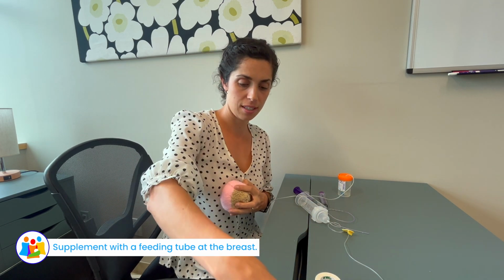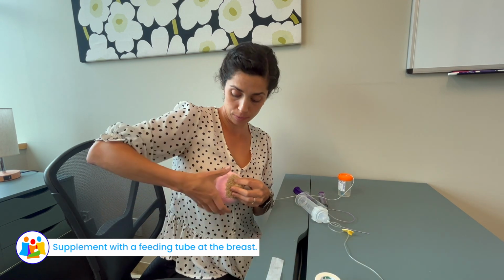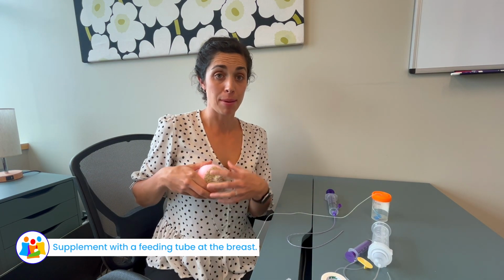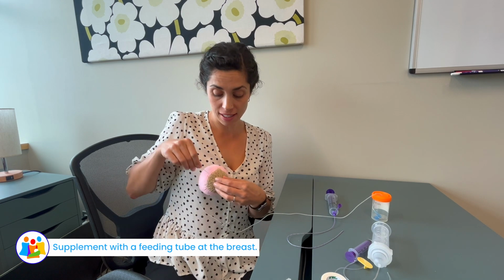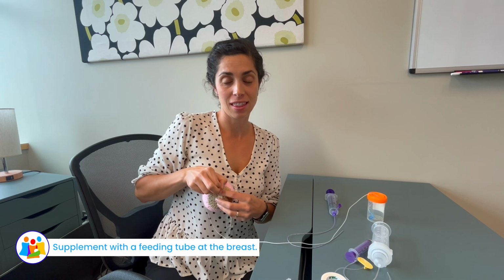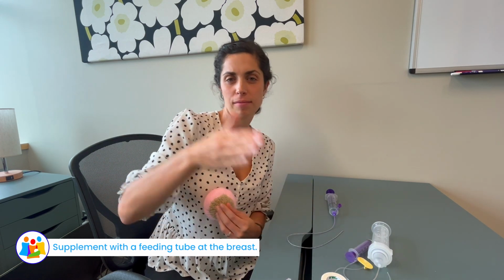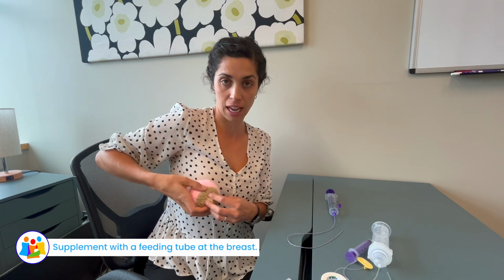Some like to tape it on the breast first and then have the baby latch around it. Some moms like to just hold it with their thumb while the baby is latching, and then the baby gets on it on their initial latch. Some people like to get the baby latched first and see the baby form that seal and start their suckling, and then slide the tubing in the corner of the baby's mouth, just as much as for those 3 little holes to be in, and then you'll start to see the milk flowing because of the baby's suction that they're generating. And that is usually what people advance to after the first little while, when they've had it lined up and the baby latching on it.